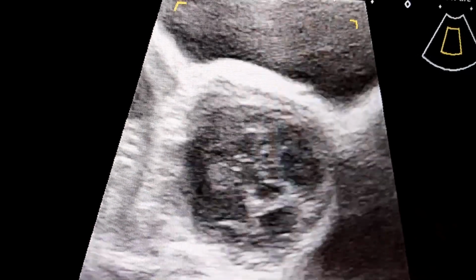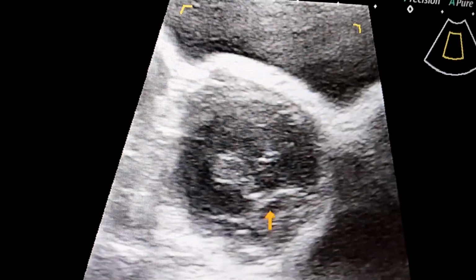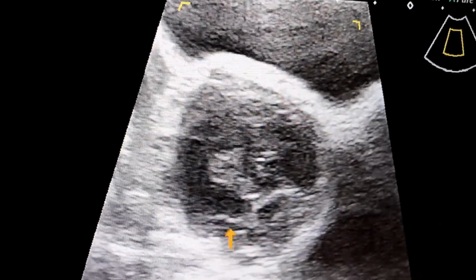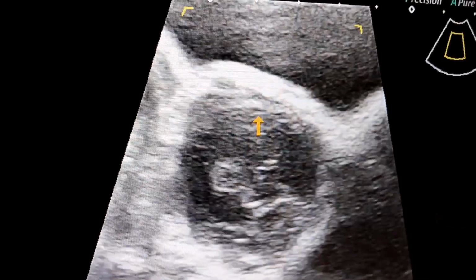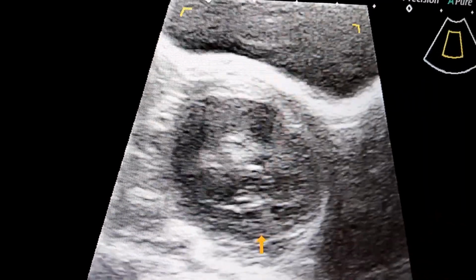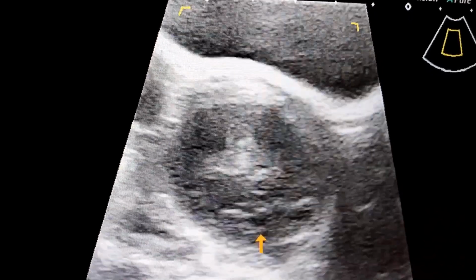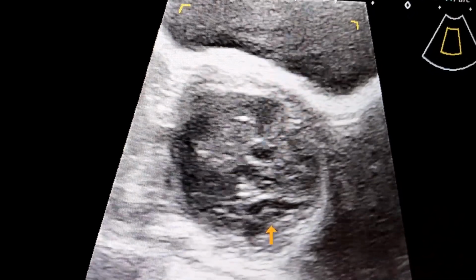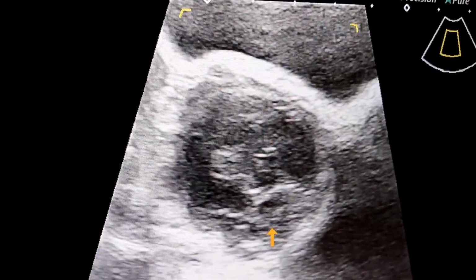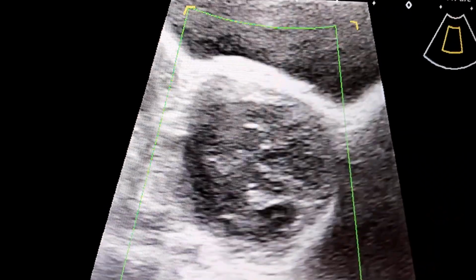So whether these echogenic dot lines and somewhat these solid areas are alarming for a 40-year age female patient. So now I'm going to put the color.